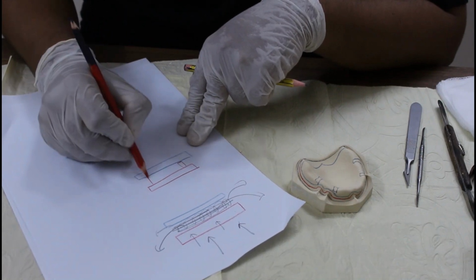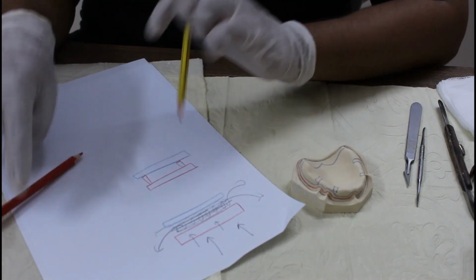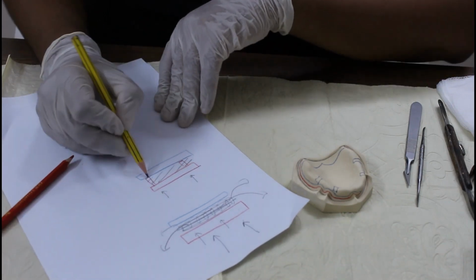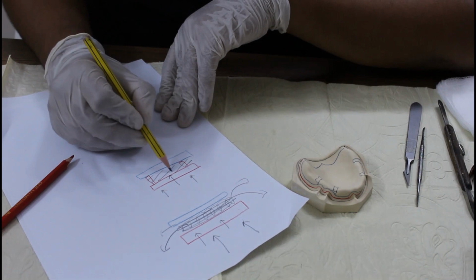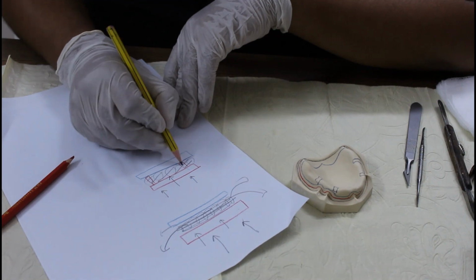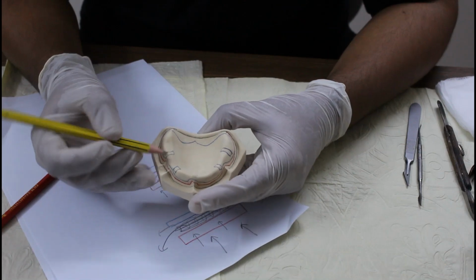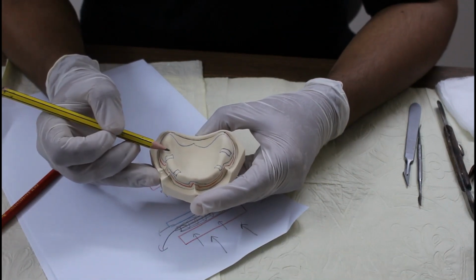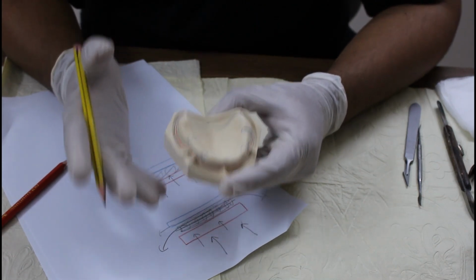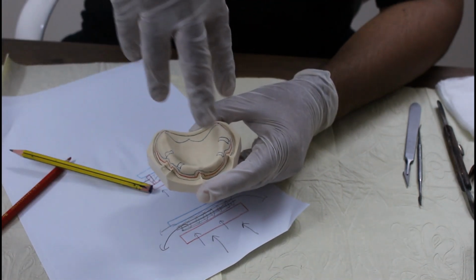This is the ridge, this is the tray. We make stops like legs of a table or a chair. So when we put impression material here, we apply pressure. These stops will not allow this to go down. They will keep the space for the impression. So this is the function of tissue stop. This is the tissue stop. We make it 4 because if you see a table or a chair, you will find a table with 4 legs is more stable as compared to a table with 3 legs or 2 legs.